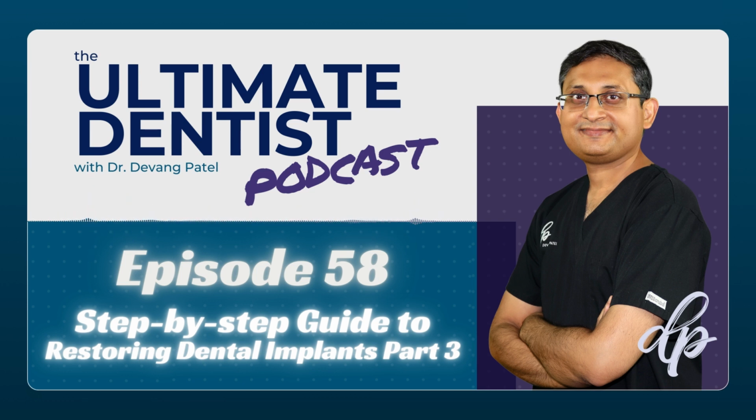The other technique, which is called the cast technique, is a much more mature and older technique, where we mill the custom abutment in chrome or gold. When I used to make my own implant restorations, when I did my MSc, we did our own. If I placed an implant, I would take the impression, pour the model myself, wax up the implant, cast that implant restoration in gold, and do the porcelain on top, everything myself.